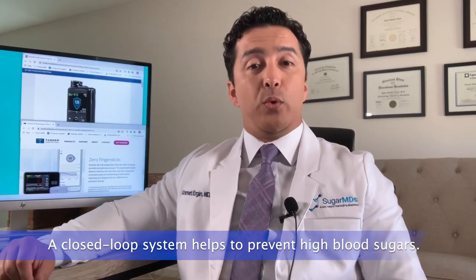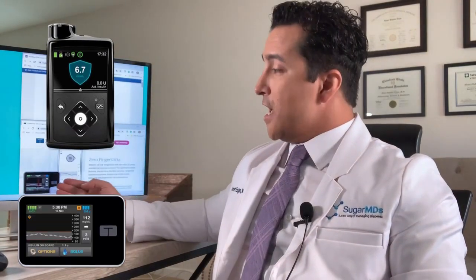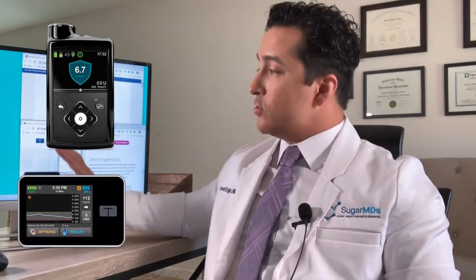If you've used insulin pumps before, you know there have been a lot of developments in this area. You may have been using Basal IQ with Tandem, or the 630g or 640g with Medtronic. They had something called threshold suspend to prevent low blood sugar. Now we have closed-loop systems that also help prevent high blood sugars. Medtronic 670g and Tandem have their own sensors; Tandem partners with the Dexcom G6.